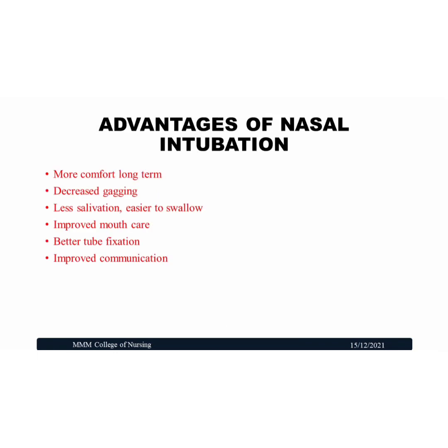What are the advantages of nasal intubation? More comfort long term, decreased gagging, less salivation, easier swallowing, improved mouth care, better tube fixation, and improved communication.